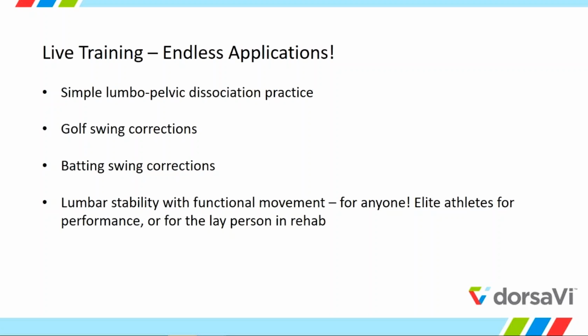So what we actually did was we went into the live training and took them into their hitting stance and made that their neutral. Each time they swung, the next time they'd have to bring the balls back exactly to the neutral again, and put the lumbar spine right in the crosshairs there. You could just do it as an ongoing visual reminder. I love the live training because you can use it for mobility issues and for stability. You can either move the balls or keep the balls still. Just think about all the different applications.